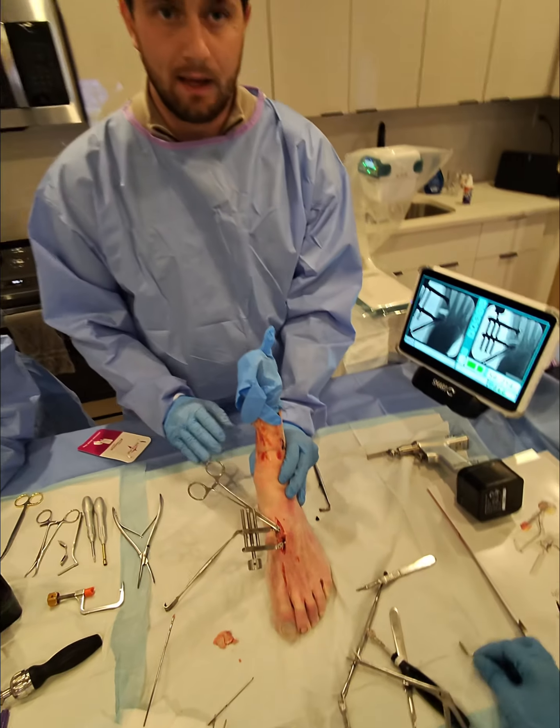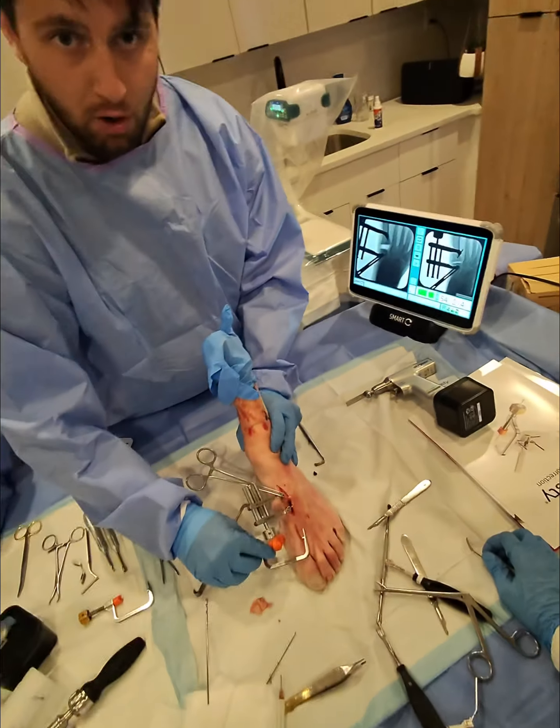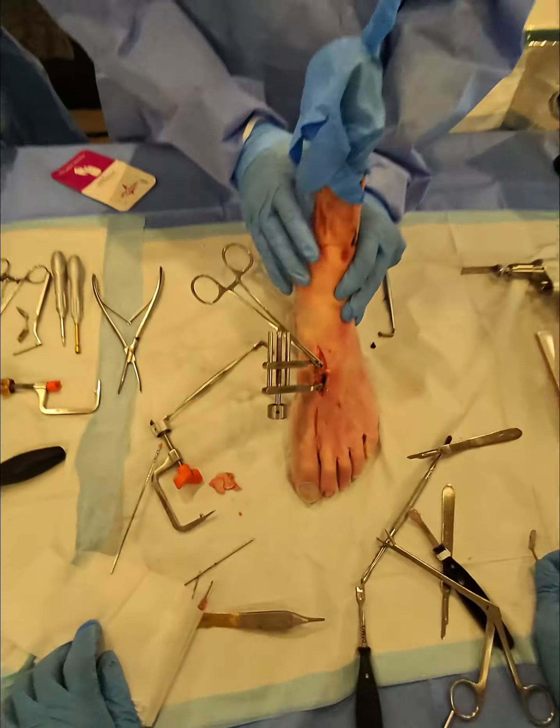At this step, you can dial in your correction more. So if you wanted to, you could put the orange comb back on, or you could change if there's any translation you want to do.